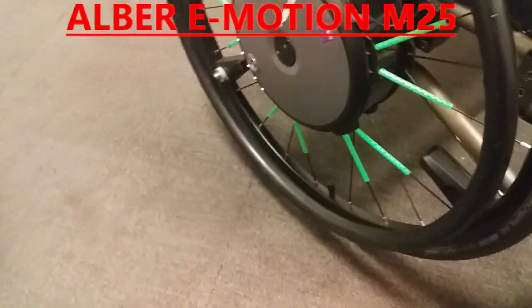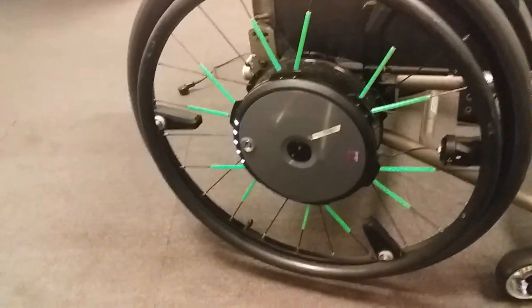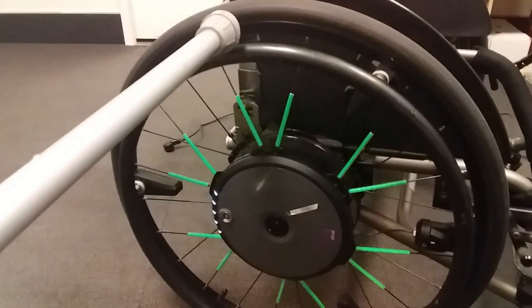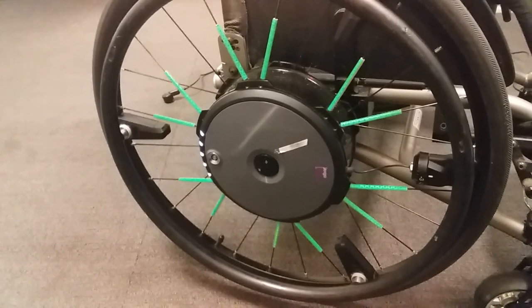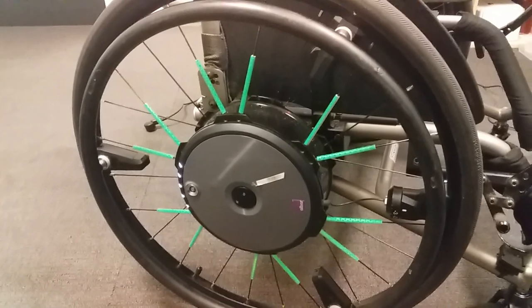So these are the E-motion wheels. I'm just moving that forward so you can see it. If I touch this part here it will go forward really quickly. I don't want to do that because it's not very nice — it scares the hell out of you basically.